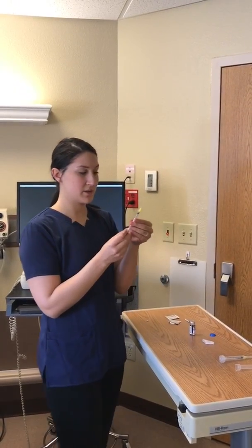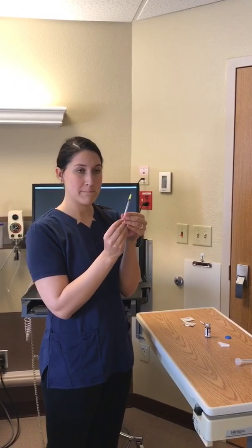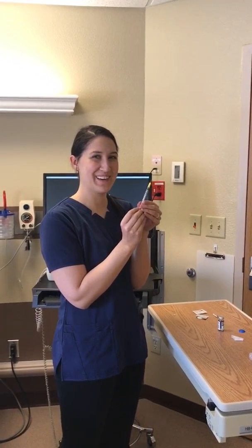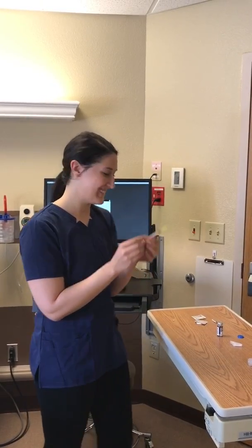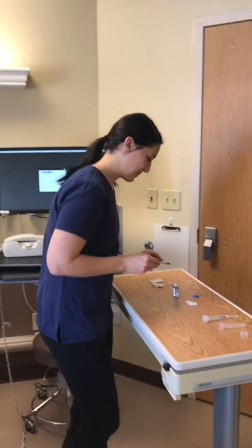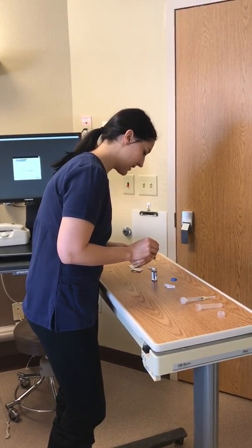Okay, so the first thing I'm going to do is go ahead and inject 0.1 mils of air into my syringe. I'm going to go ahead and place that into my vial.